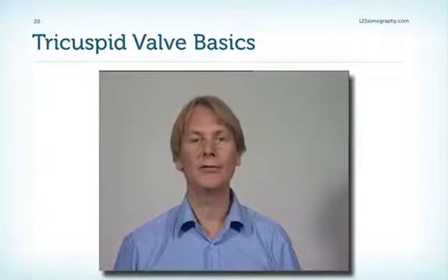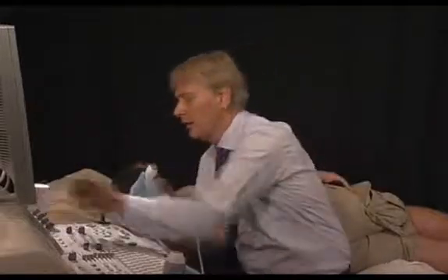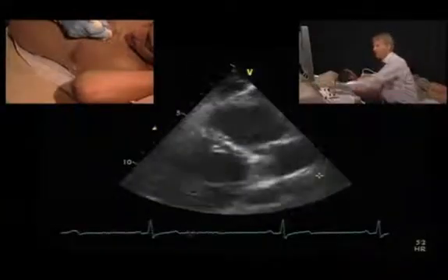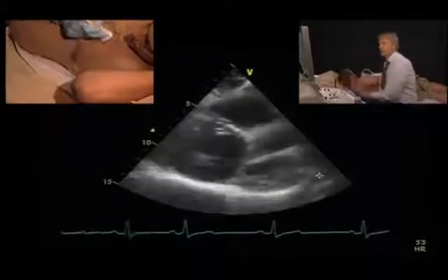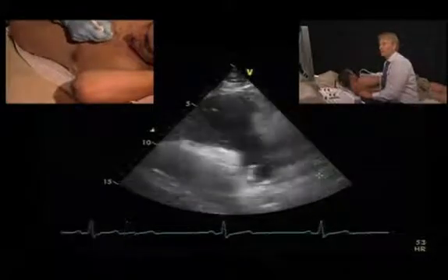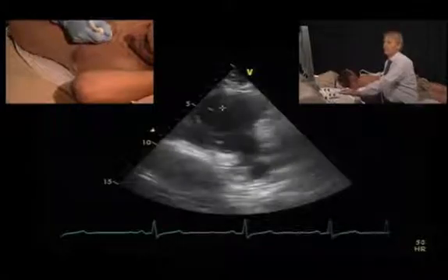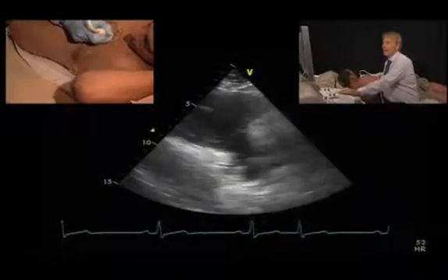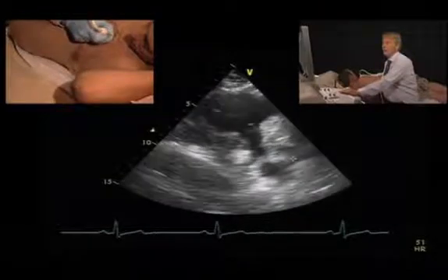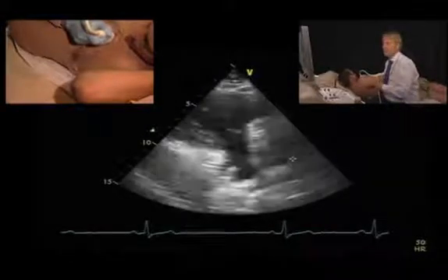Here is a patient demonstration showing how to name and image the different leaflets of the tricuspid valve. The first view is the parasternal long-axis view of the right ventricle. You tilt the transducer downwards and you will get the tricuspid valve. This is the right ventricle, this is the right atrium, and this is the tricuspid valve — this would be the anterior leaflet and this is the septal leaflet. From this view it is often possible to quantify the maximal TR velocity, especially if you have eccentric TR jets.